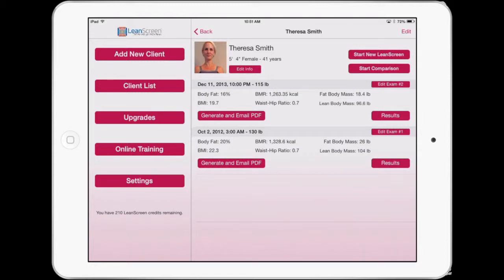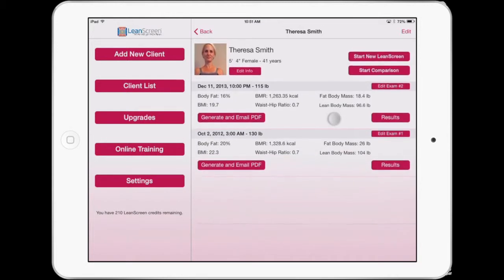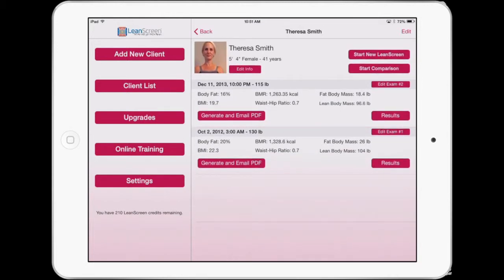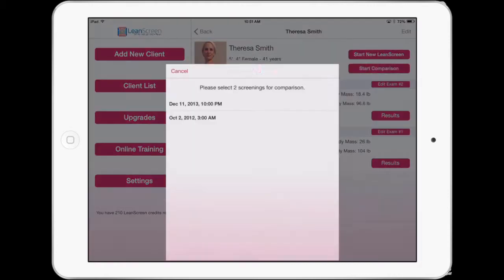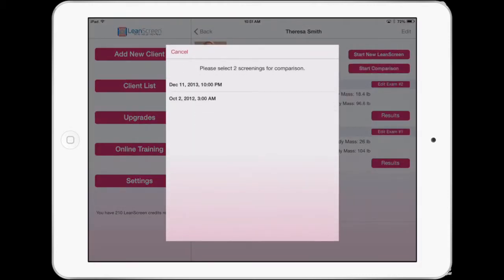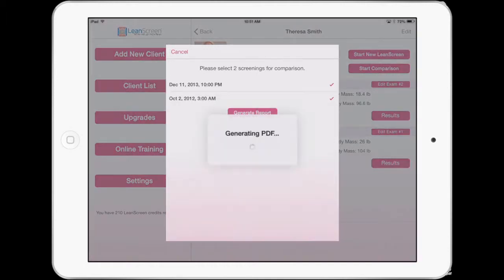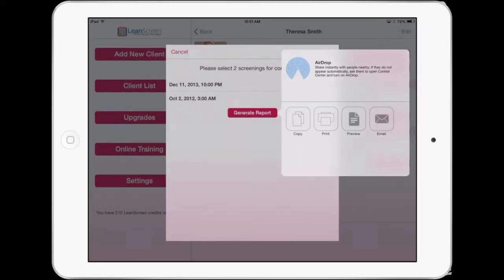One of the exciting new features of LeanScreen is the comparison module. What that allows us to do is drill down into a person's exam and notice that we have two different dates of service for this person — they went through some sort of exercise regimen and weight loss regimen. If we go through and click 'Start Comparison Report,' all we have to do is select the dates and we can compare any dates and generate a report. This is going to generate a PDF document on the fly.